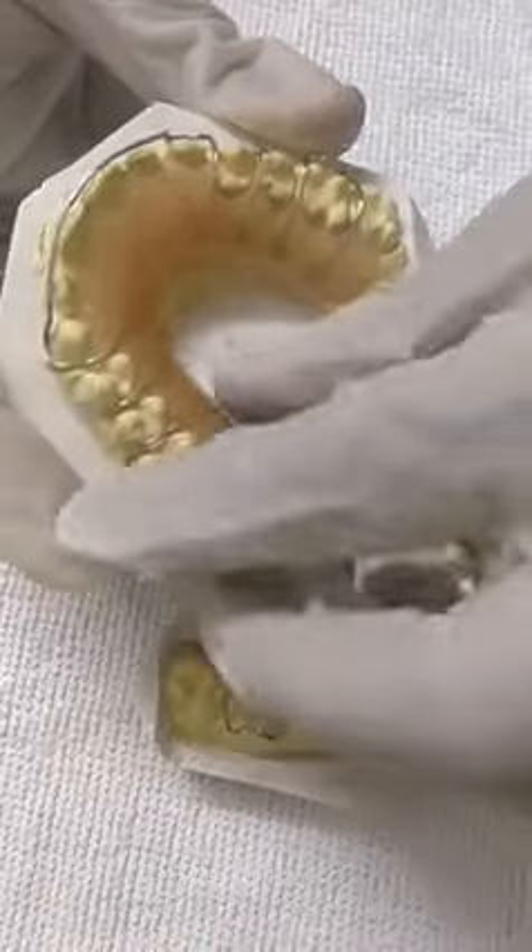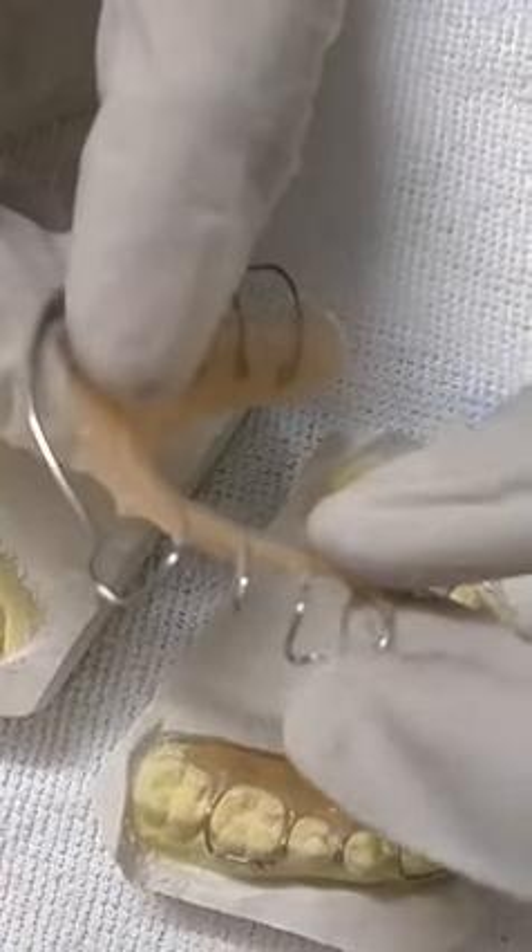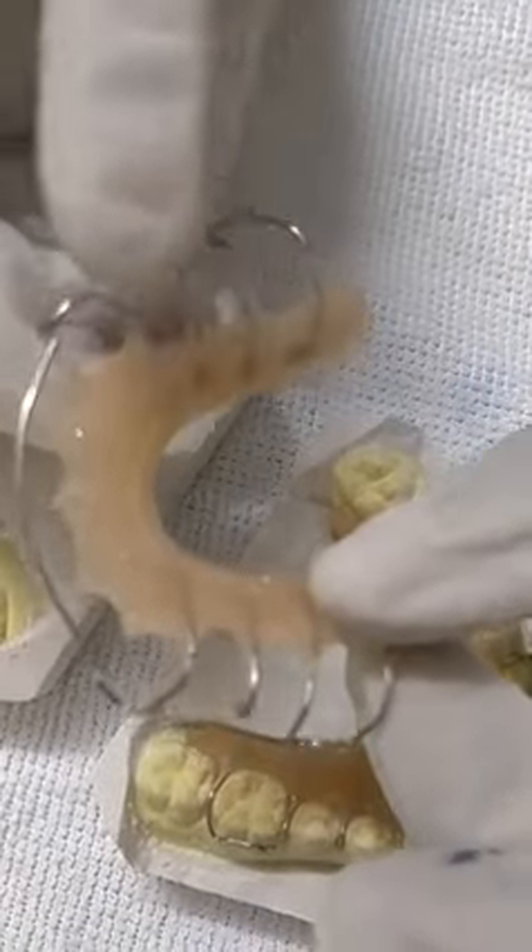These are the retainers. This is made with 21 gauge stainless steel wire. This is the Adams clasp, this is the Pinhead, and this is the Labial bow.